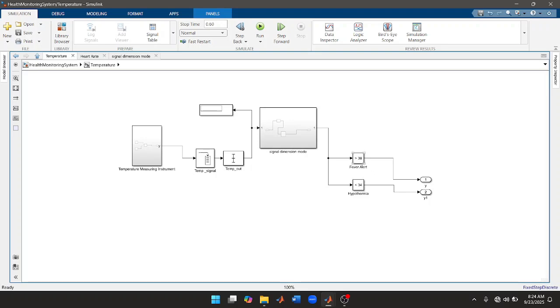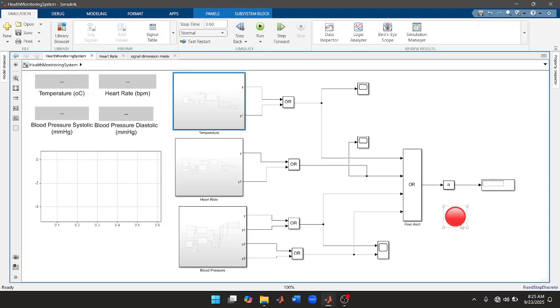Now, if the temperature is above 38, there's a fever alert. That means the patient is in danger of a fever. Then if the temperature is below 34, that means the temperature is low, and the patient is suffering from hypothermia. Whichever way, this system is going to send a signal alert, which is this button.